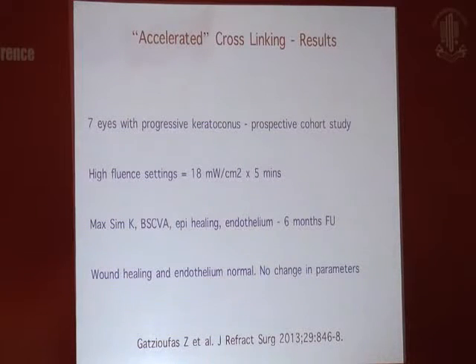This is a more recent advance, and therefore there are not as many studies published in the literature. This is a small series of 7 eyes in a prospective cohort study, which was treated with 18 milliwatts for 5 minutes, and the authors indicated that the procedure was quite safe. The corneas healed quite well, there was no endothelial damage, and at 6 months follow-up, all the parameters remained stable.